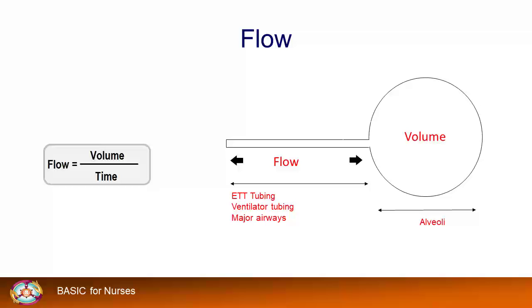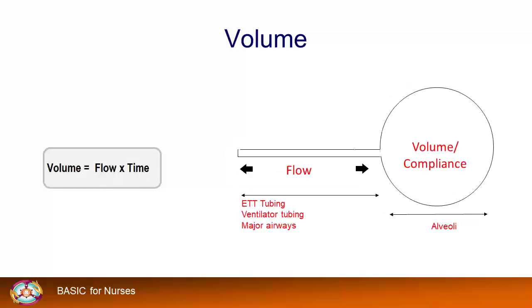This flow creates the volume of the breath. The volume of breath is a function of the rate of flow and how long we allow the flow to continue. Therefore, volume is equal to the flow of gas times time. The volume will be affected by how stiff the balloon is, the compliance. Consider the difference experienced blowing up a new balloon compared to one that has become stiff because it's old or damaged.